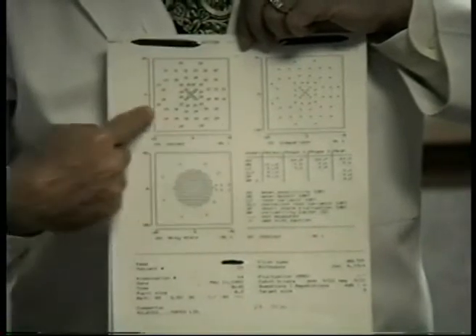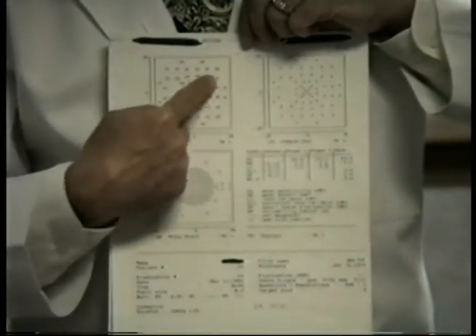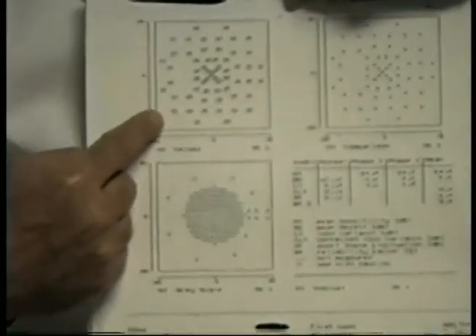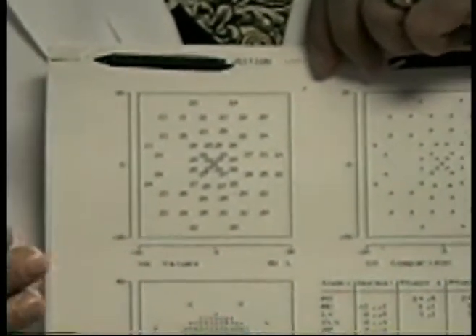This is the actual test results. You'll notice that there's a number in a lot of different locations. This is each of the locations that was tested, and there's a number. The higher the number, the more you see. The lower the number, the less you see. Okay? So the higher the number is, the dimmer the light was that you could tell. It's sort of an inverse relationship. So the higher the number, the dimmer the light was. So that means you have more sensitivity to light in that spot.